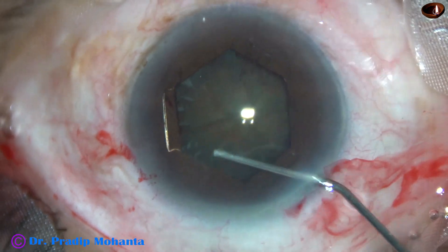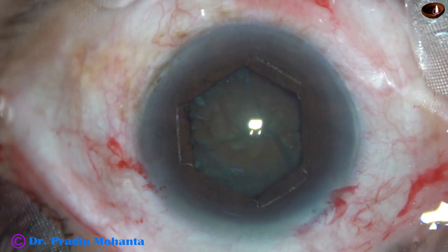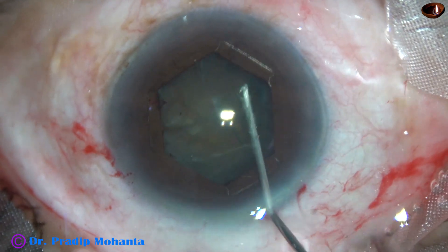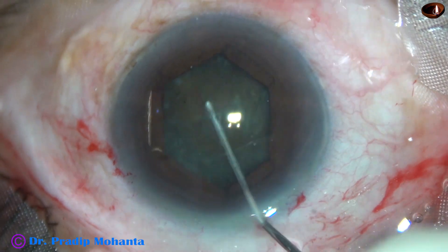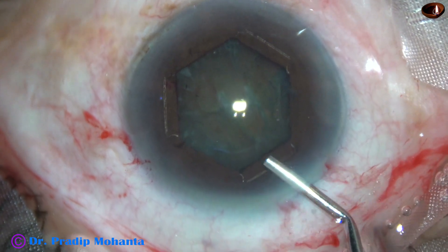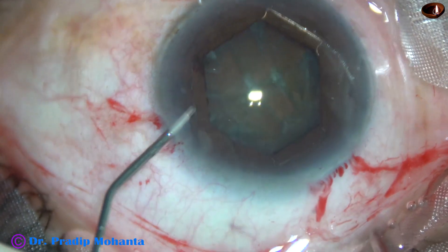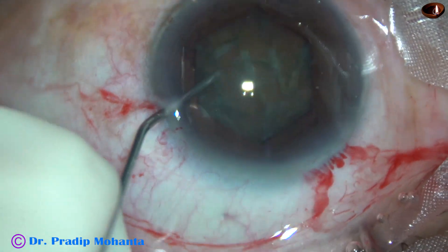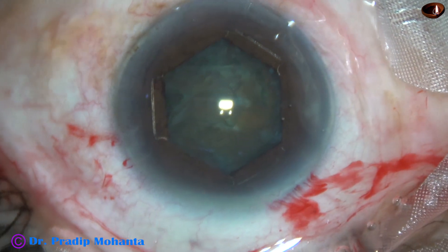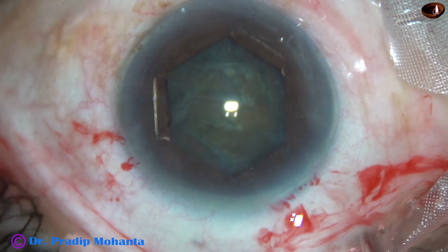This is hydrodissection. Hydrodissection is done very carefully with a minimal amount of BSS injected at multiple points. The nucleus is tapped. Now, I inject a bit of viscoelastic, go through the side port again, and try to rotate the nucleus. I find that the nucleus is rotating nicely. Some more viscoelastic is applied to protect the corneal endothelium.